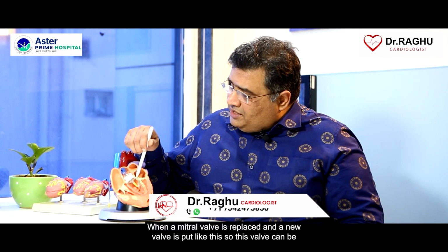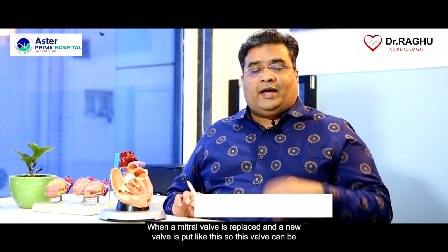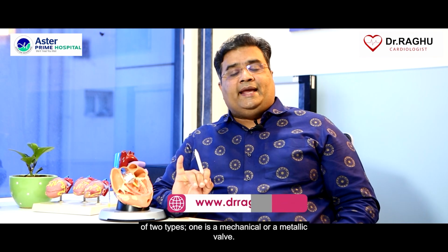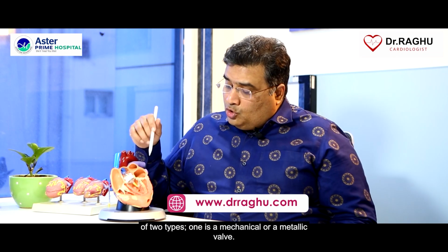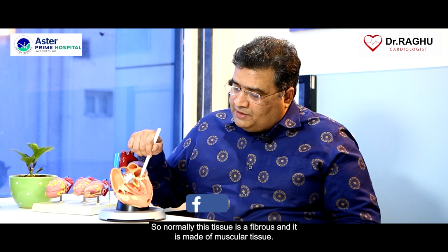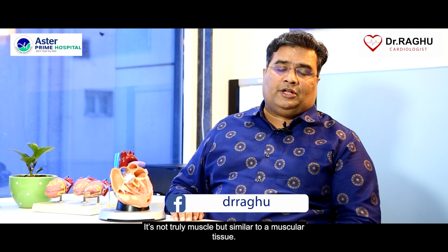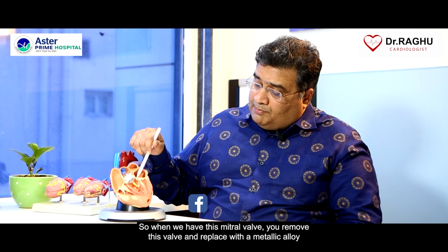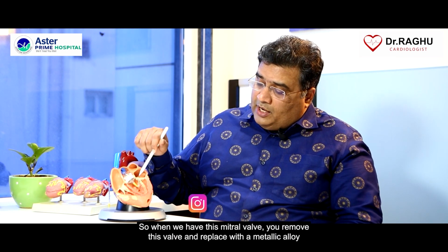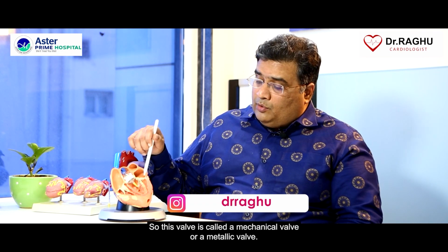When a mitral valve is replaced and a new valve is put in, this valve can be of two types. One is a mechanical or metallic valve. Normally this tissue is fibrous, not truly muscle but similar to muscular tissue. So we remove this valve and replace it with a metallic alloy valve. This valve is called a mechanical valve or a metallic valve.